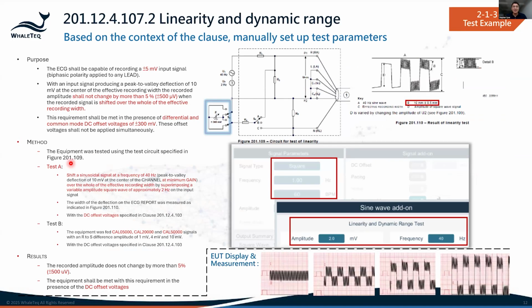Another example we have today is the linearity and dynamic range. On the left is the clause from the standard.